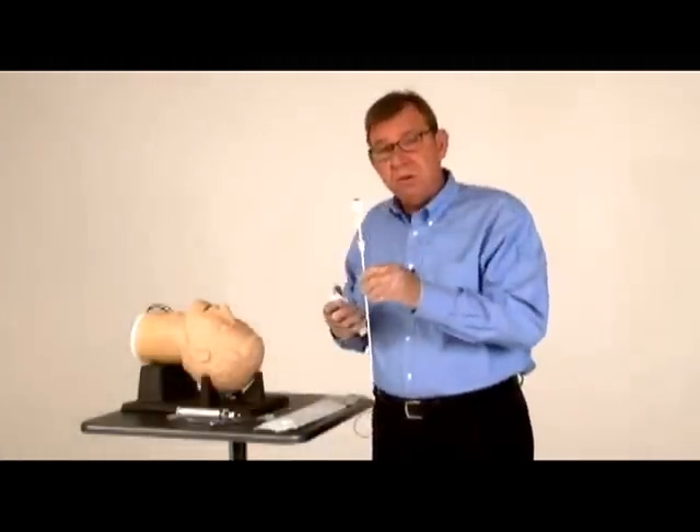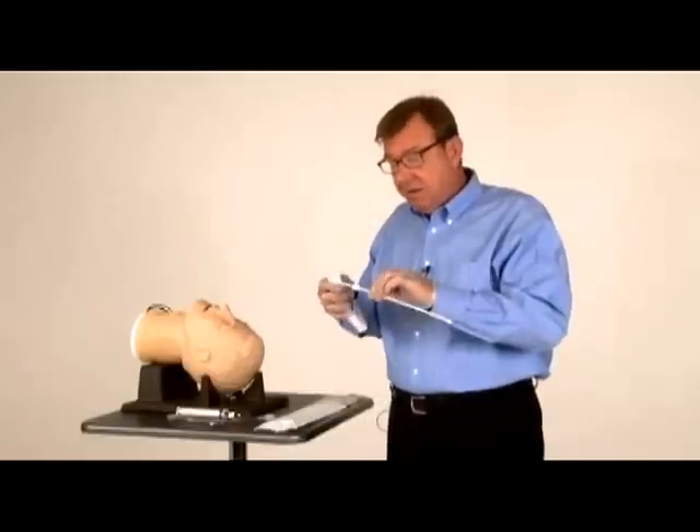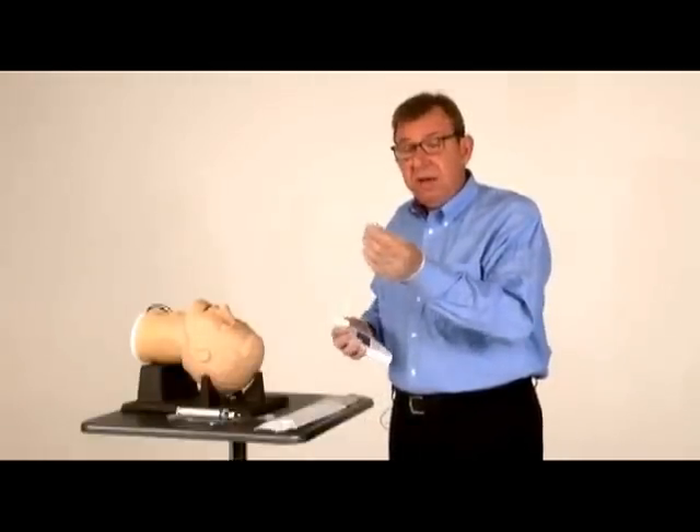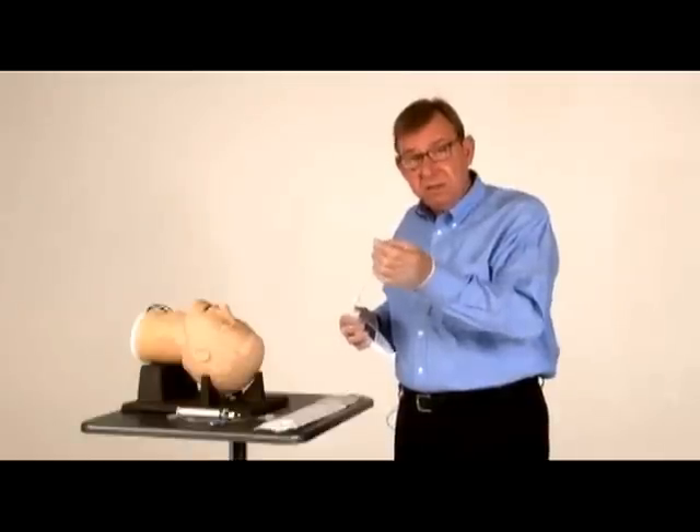The other part is the disposable — this is the video stylet. It has a fiber optic channel that carries light from the handpiece to the tip and a CMOS camera chip in the end of the stylet.